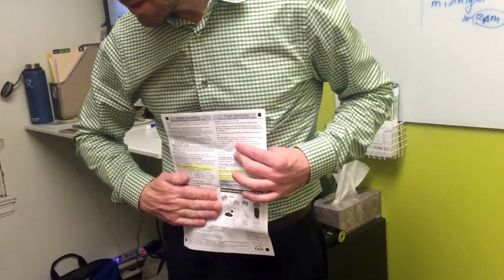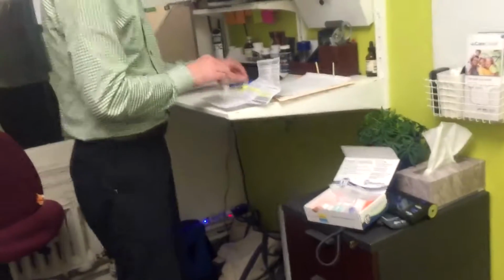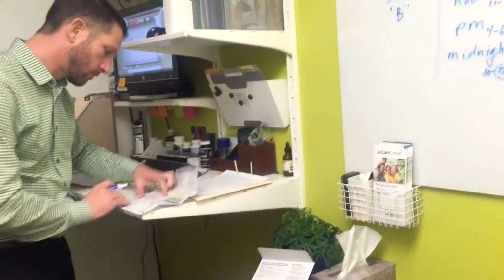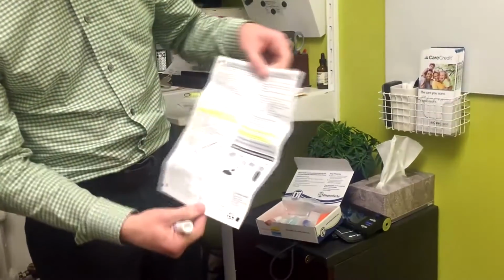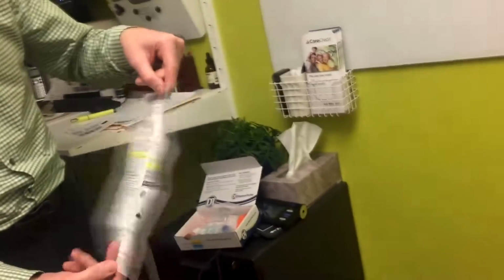Disregard this bottom section right here. I'm going to put an X on it. Okay, so that section on the X. Am I sending this back then? Yep, that goes to the lab.